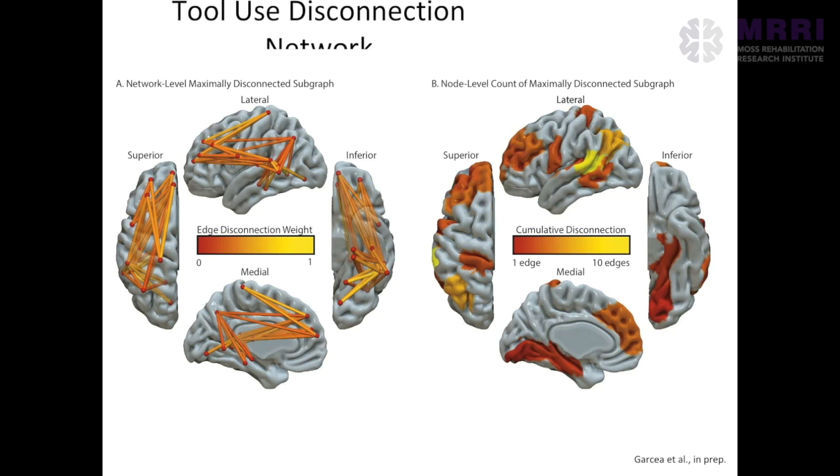What I wanted to do is keep it close, doing connectome symptom mapping and voxel symptom mapping using the same code, the same pipeline. The only thing that changes is the data that you give it to learn the relation between damage in the brain, whether it's voxel level loss or connectome level loss, and behavior. So the only thing that changes are the inputs, the data. The behavior stays the same, the same participants, same lesion size. Then you can start to look at correspondence, and you can also start to look at differences across these two types of analyses.